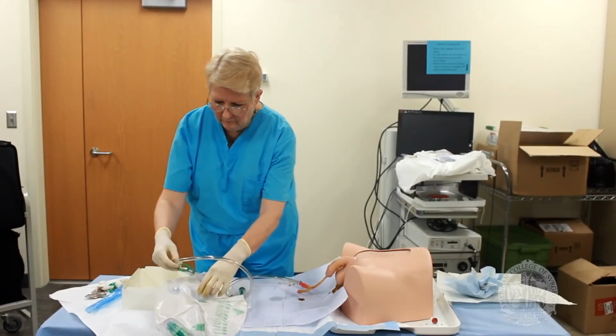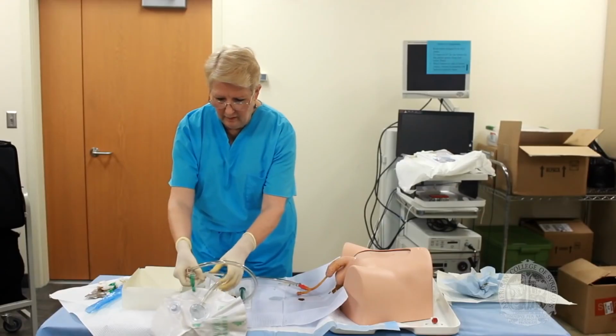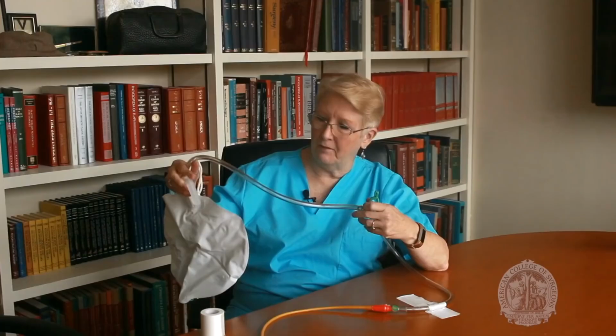If the patient is immobilized or unable to move, this can lead to ulcers, but it is acceptable in an otherwise healthy patient who will not need the catheter for more than 72 hours or so. Regardless of how you secure the tubing, it is crucial to ensure that there is no tension on the tubing. The tubing can then be clipped to the sheets or the patient's gown. The bag should be placed in a dependent position and maybe hung by the string or the hanger above the bag.